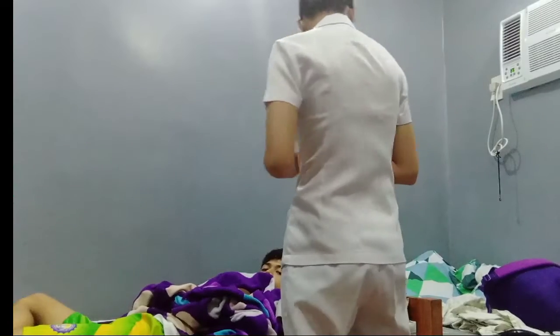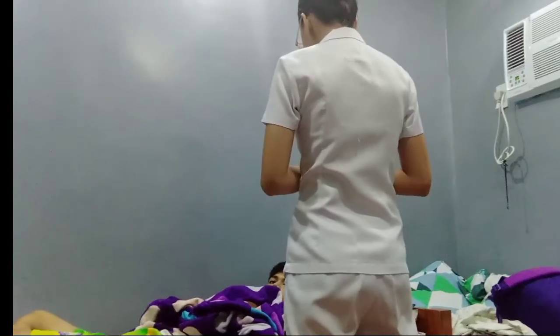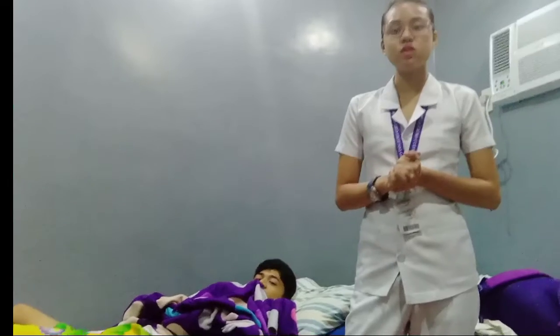So Hazli, today I will be administering to you, as instructed by your doctor, your insulin. Okay, so when was the last time that you were given medication? 10 a.m. Okay, thank you so much. So afterwards, we need to determine which site you will use.